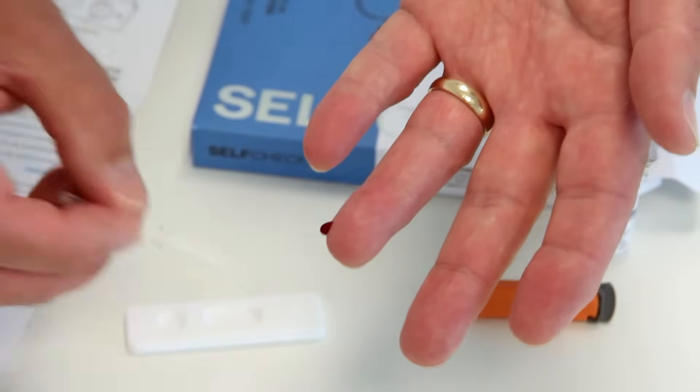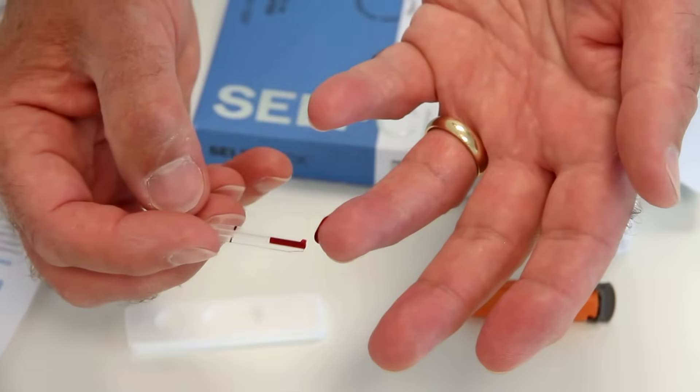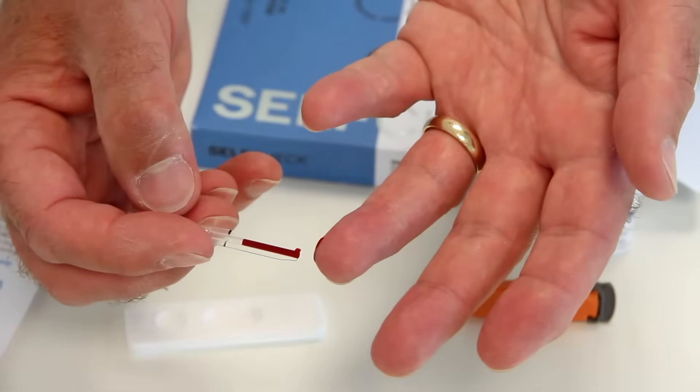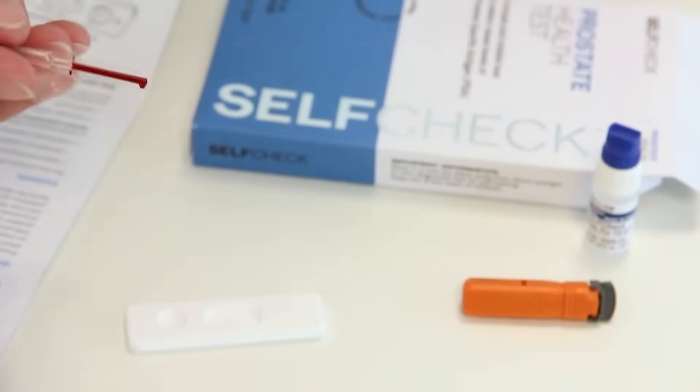Squeeze your finger gently to obtain a large drop of blood, then touch the end of the plastic pipette to the blood drop. Blood will flow automatically into the pipette. There is no need to squeeze the pipette bulb. Continue collecting blood drops until the pipette is filled to the black line.